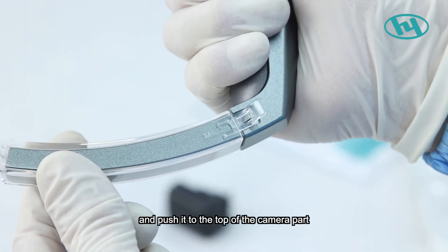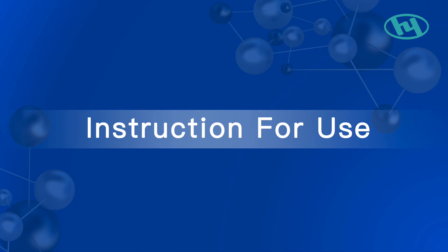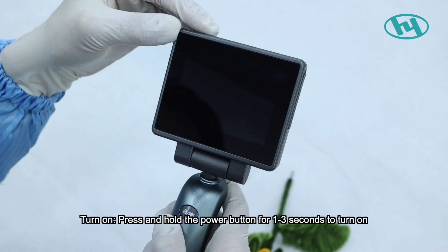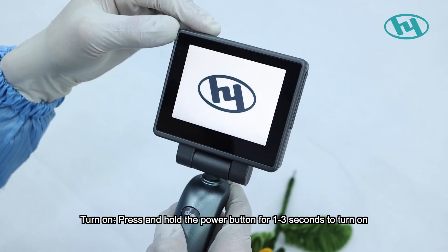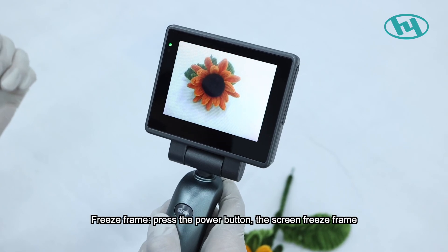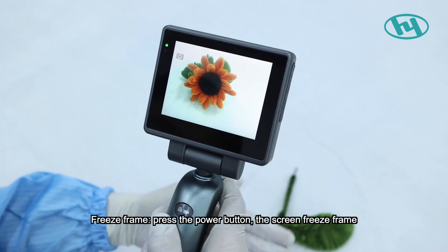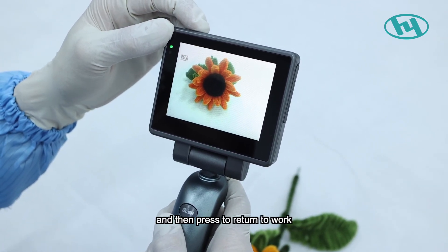Push the blade to the top of the camera part and make sure it is locked without loosening. To turn on, press and hold the power button for one to three seconds. For freeze frame, press the power button — the screen freezes — then press again to return to work.